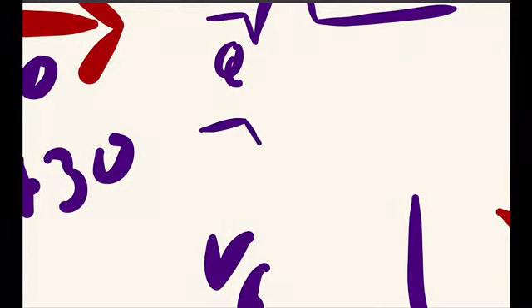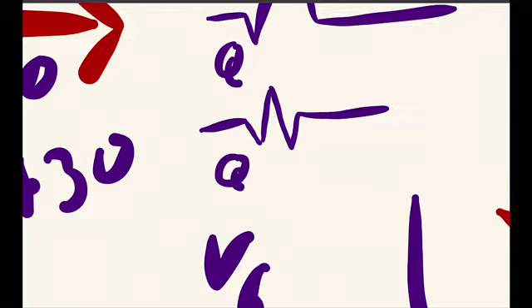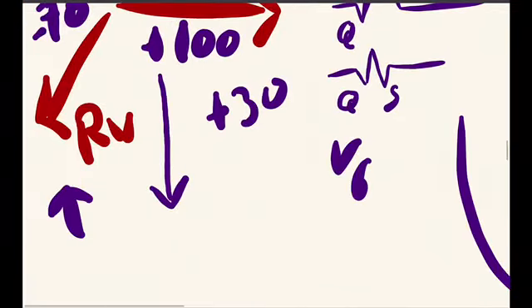There is no effect on the septum, but the height of the R wave will not be the same, and there will be a negative deflection, and the S wave can be seen here in the V6 lead. So it is the right ventricular hypertrophy that is causing this.